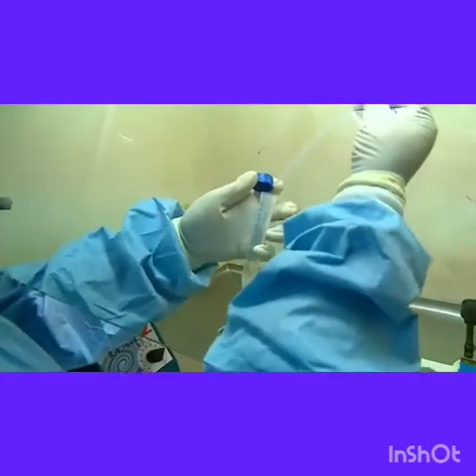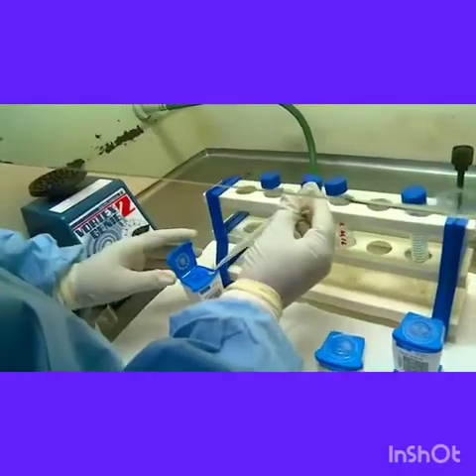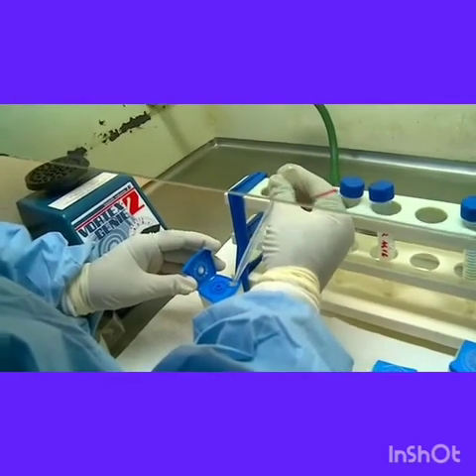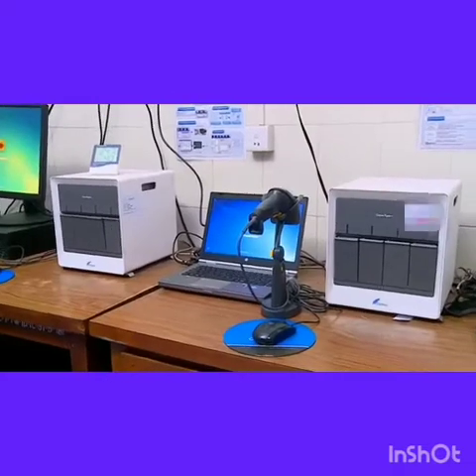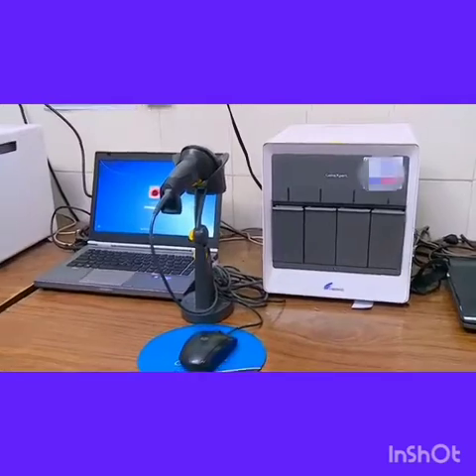Using the Pasteur pipette, 2 ml of the homogenized suspension is taken. It is added to the cartridge through the aperture provided in the corner. The pipette is then discarded into the disinfectant bath.